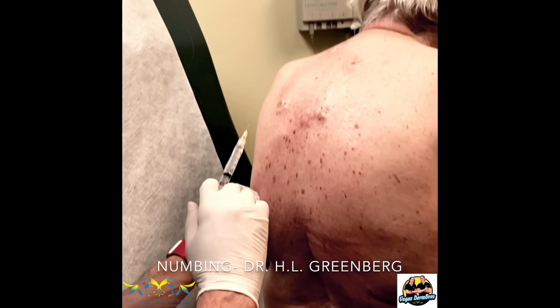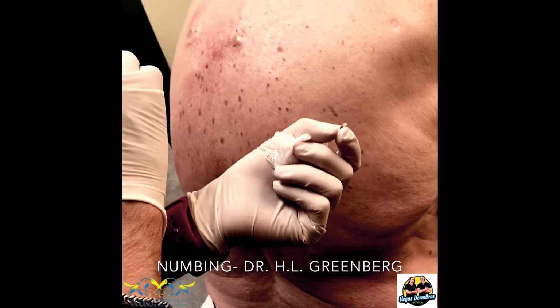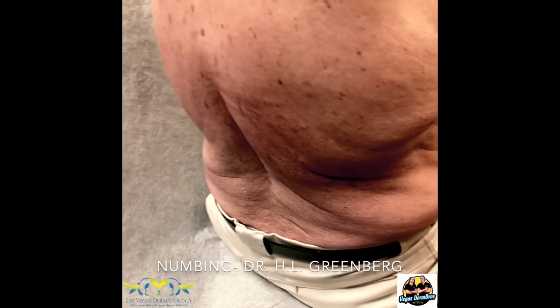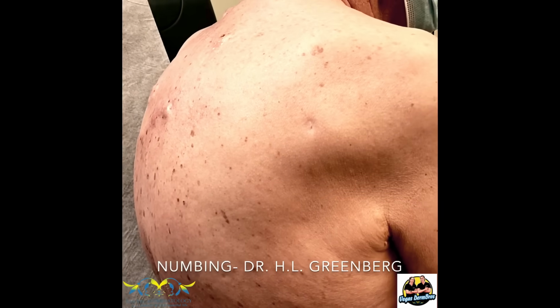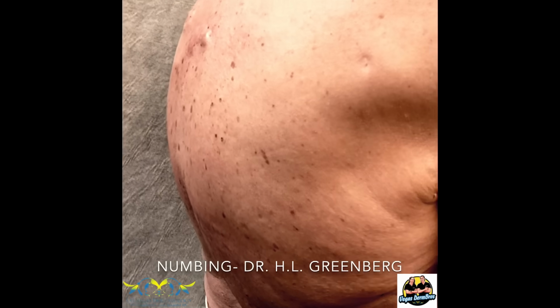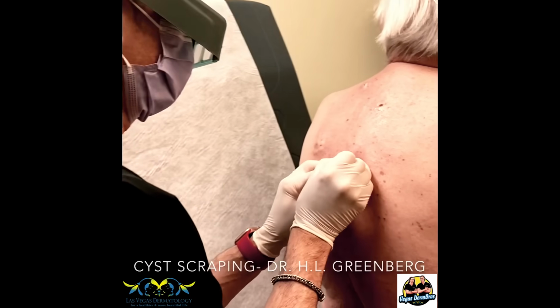That's okay. Is this genetic? Oh. Yeah, that one just came out. What is that? Dead skin cells? It's keratin. Keratin's like a plug from the follicle. And actually what we need is a comedone extractor. So we're going to nick each one.